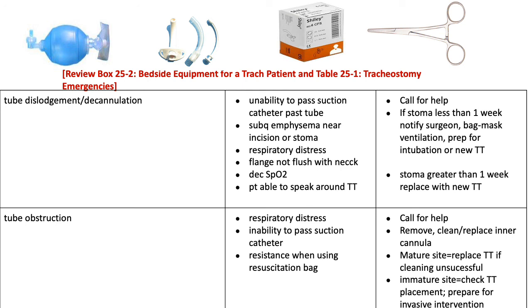So call for help. Don't leave the patient. Again, stoma less than a week. This is a medical emergency. Surgery needs to be notified. You will provide ventilation via a bag mask, mask ventilation. Prep for intubation or a new tracheostomy tube.